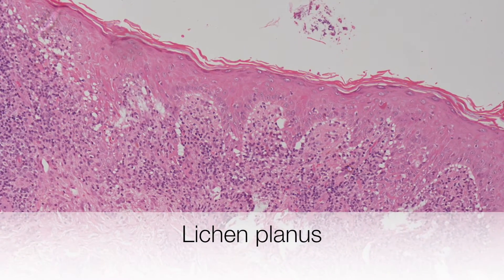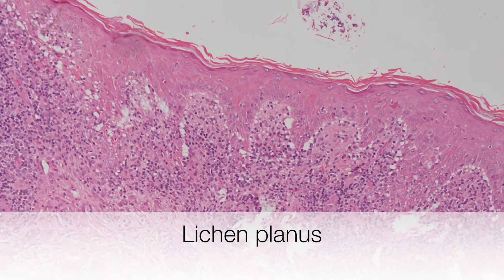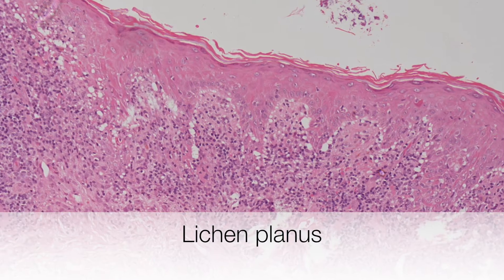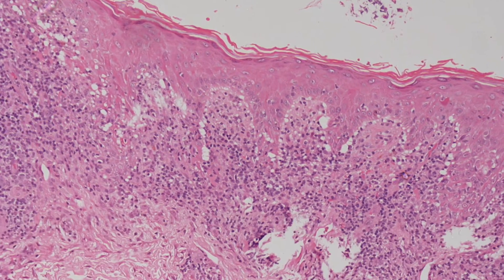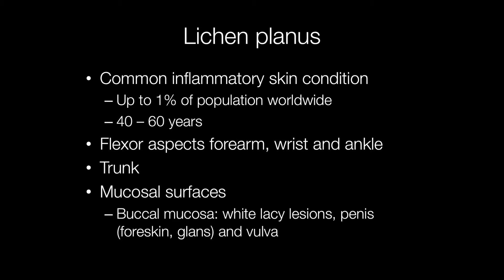This skin biopsy shows the typical appearances of lichen planus. Lichen planus is a non-infectious common inflammatory skin condition that affects probably between 0.2 and 1% of the population worldwide, and the age it tends to occur at is between 40 and 60 years old.